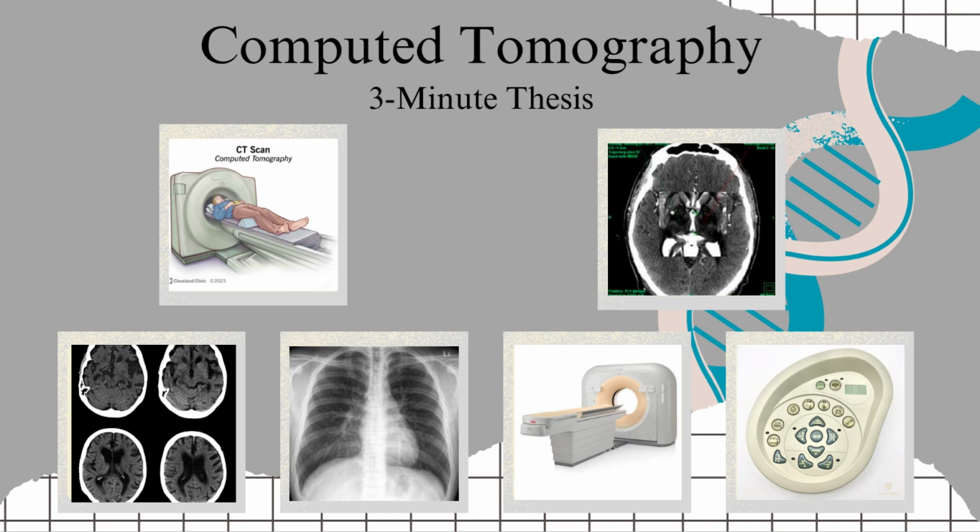CT can also be used to perform a non-invasive procedure known as a virtual colonoscopy or CT colonography. Instead of traditional colonoscopy, which involves inserting a long tube into the colon, virtual colonoscopy uses CT scans to create detailed 3D images of the colon. It's a valuable tool for detecting colorectal polyps and cancer, offering a less invasive option for patients.